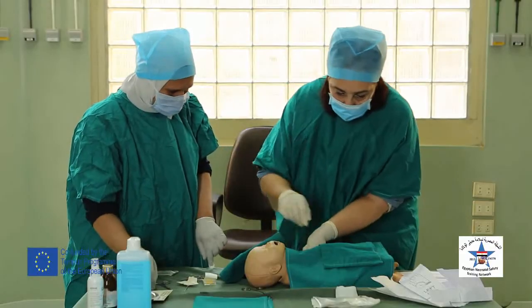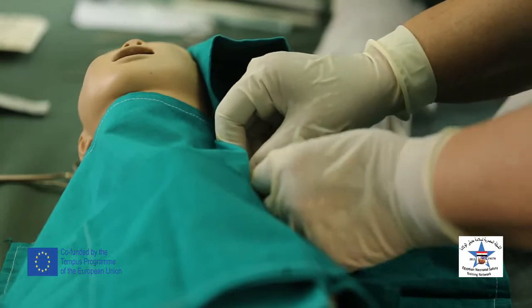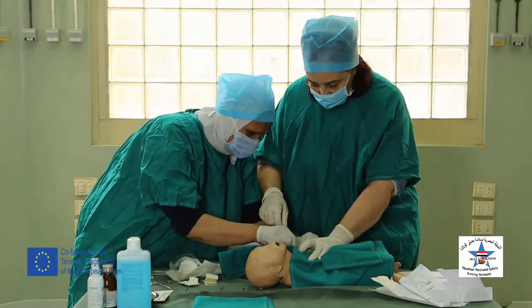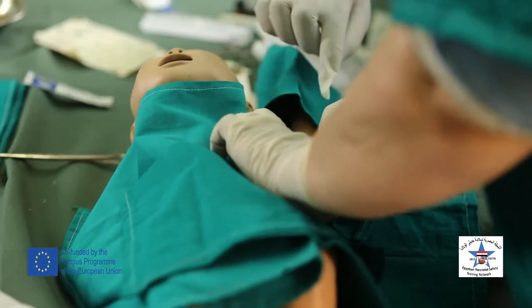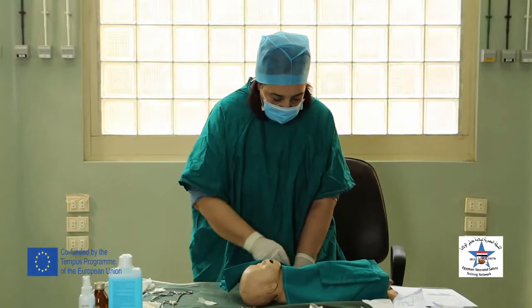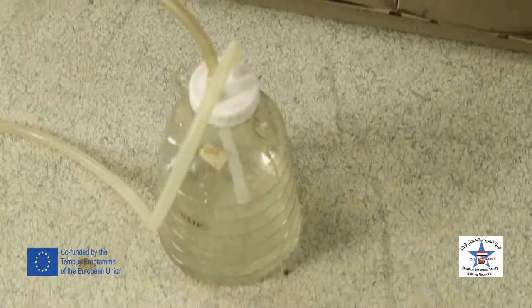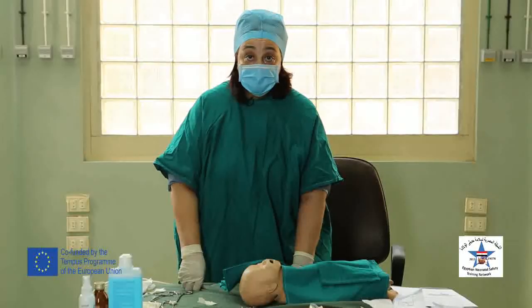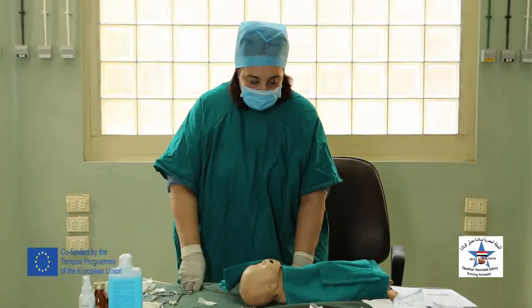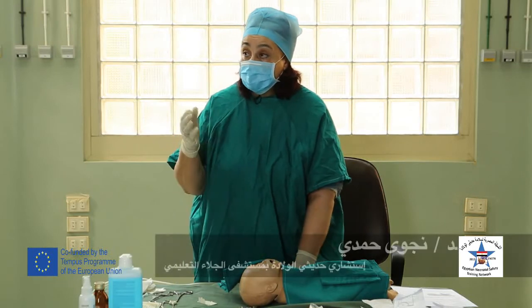I will cover it with the petroleum soaked gauze. Fix the area with Tagaderm. After fixation of the chest tube and the air is bubbling in the underwater seal, I will obtain an X-ray for this baby to make sure that the pneumothorax is draining and the lung has inflated. I will look at the cardiorespiratory monitor.